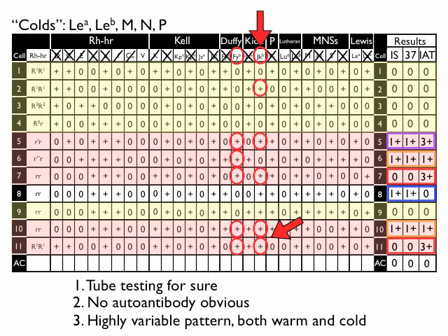If you look, you see that both cells 10 and 11 are single dose JKB red cells, and look at the difference in the IAT and the AHG reactions on the far right. You have 1+ in cell 10 and 3+ in cell 11. So it doesn't make sense that both cells being single dosed would give you that much variety in the IAT reaction. So what we can say at this point is that this is most likely an anti-Duffy B for the warm reacting antibody. Okay, well now let's look at something different.